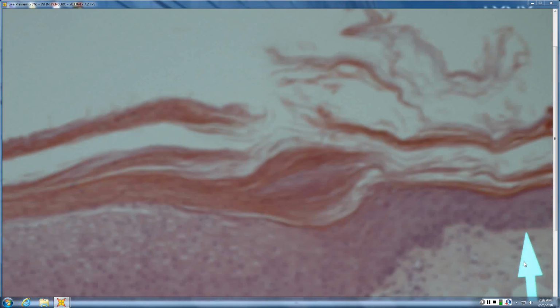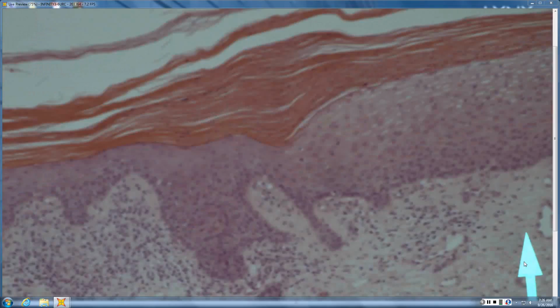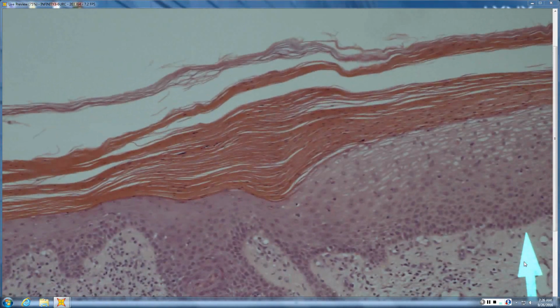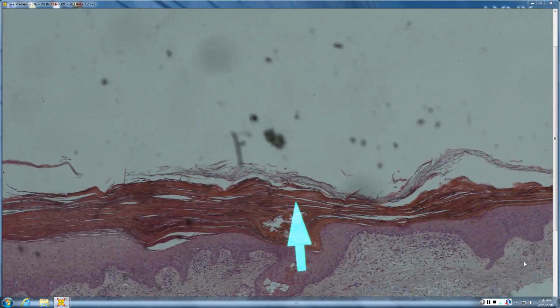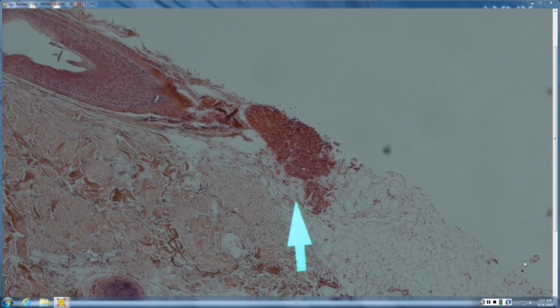With PRP, you get follicular plugging as well. So if you find a hair follicle and you see some plugging there, that goes with it as well. And that's pretty much it. So yeah, there's maybe some plugging here as well. All those things are features of PRP, but they're very subtle features. We had one recently, and we went over it with Maze.